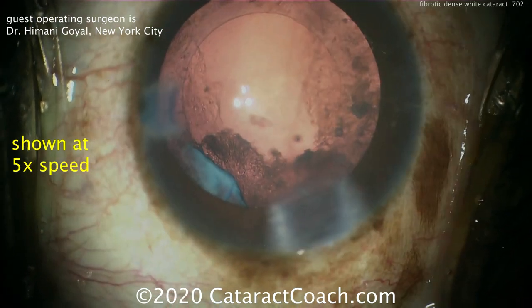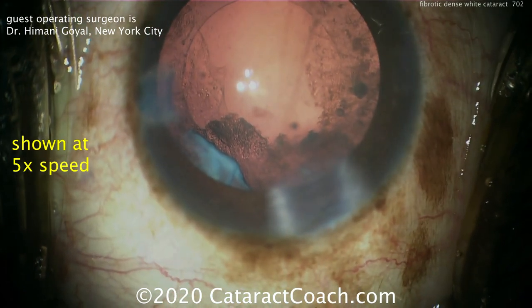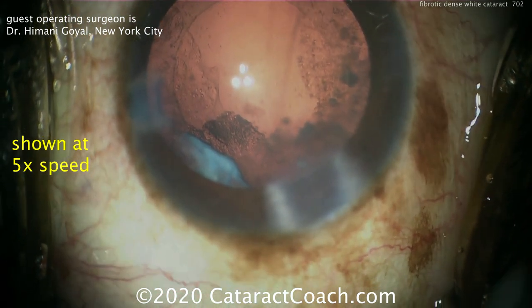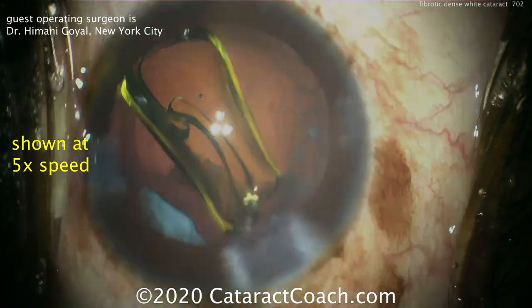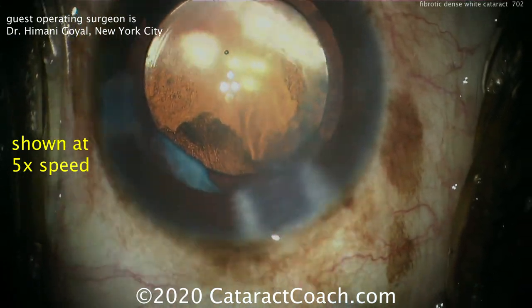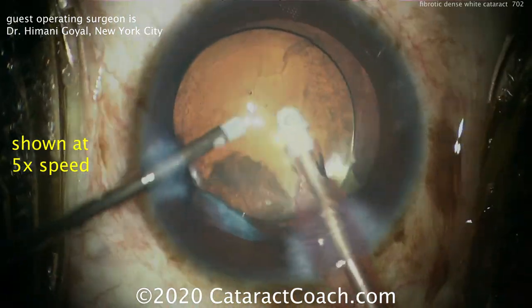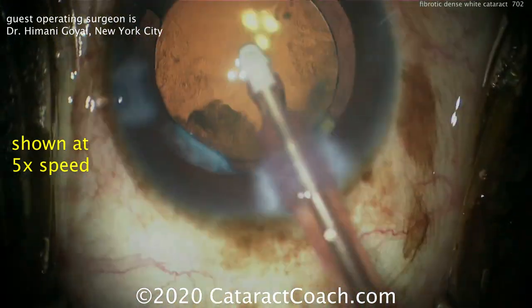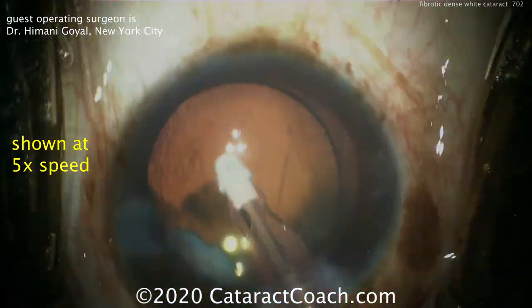There are a couple of options. You can try to pick at it, scrape it, and see if you can dissect it off, but that may not be so effective — we saw how difficult it was to remove from the anterior capsule, and pulling at the equator may be more likely to damage the zonules. So we can insert the lens, dial it into position, and notice the visual axis is clear. With the lens holding open the capsule, going in with a bimanual split of the IA handpiece to really get in there and polish off as much of the opacity as possible. It works pretty well to a degree, but certain whitish patches are just not going to come off.